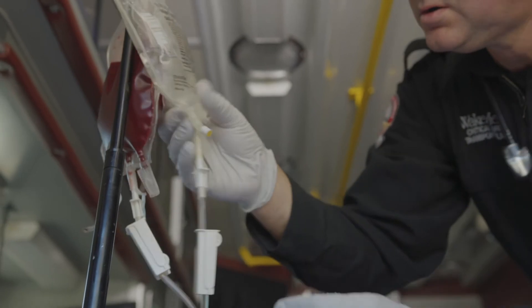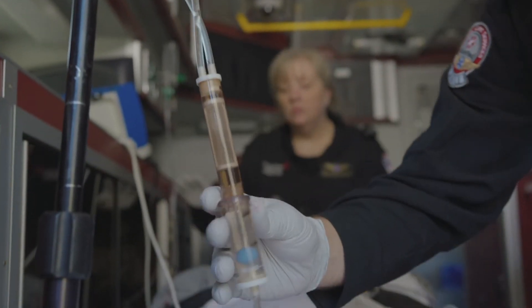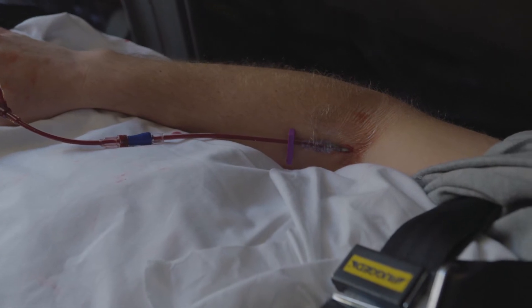Check that fluid remains in the desired bag. Ensure that roller clamps are open. Check that the filter is not clogged. Make sure the ball is not suctioned to the bottom of the air check, and check all distal clamps.